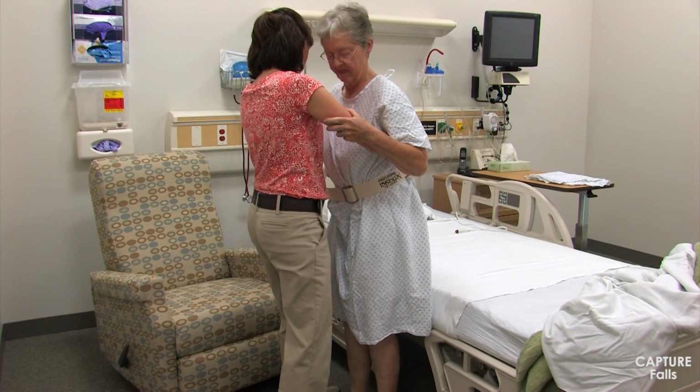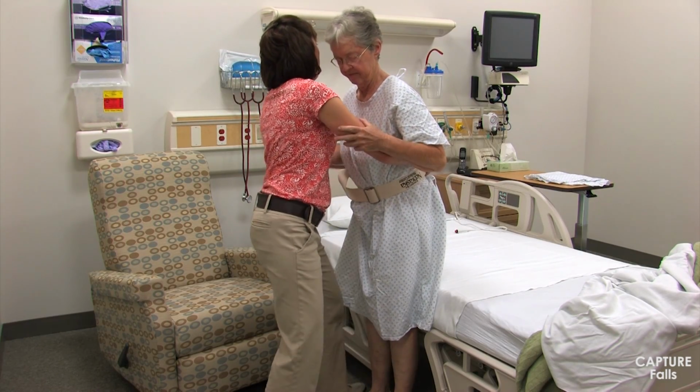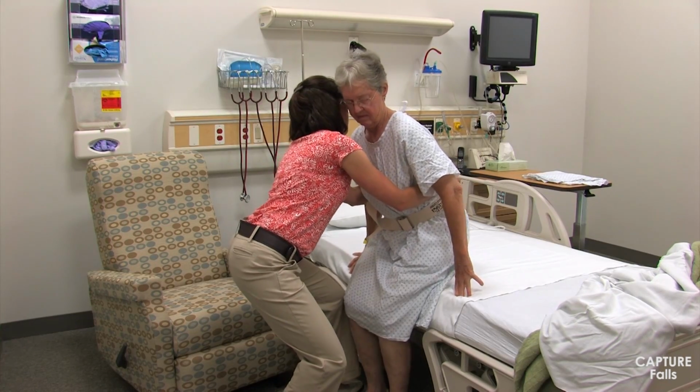To assist the patient back into sitting, I'm going to make sure she is in contact with the bed, reaching back with her arms. I'm using the gait belt to control the descent of her center of mass as she sits.